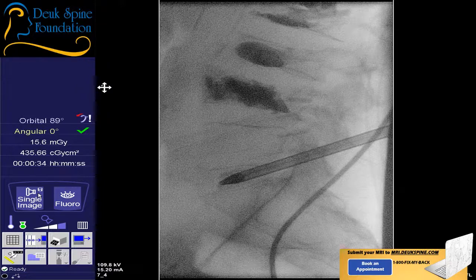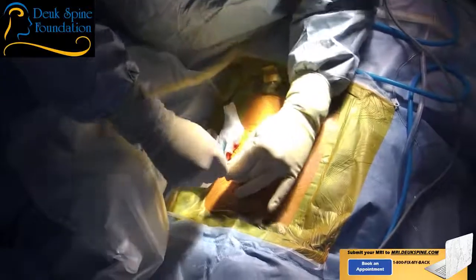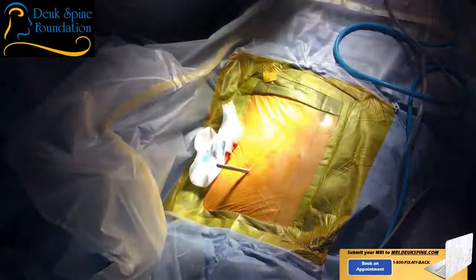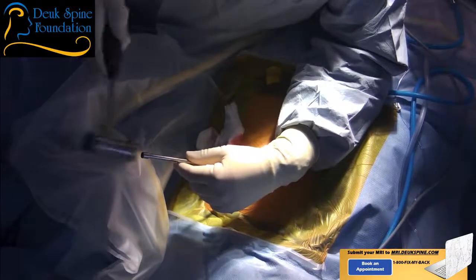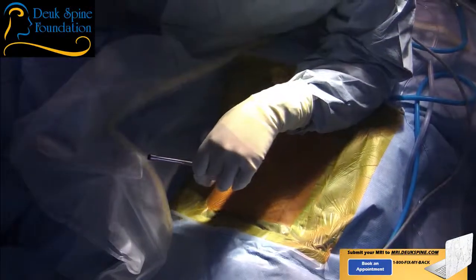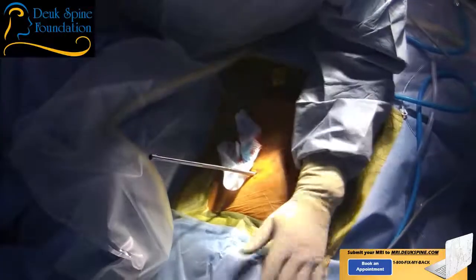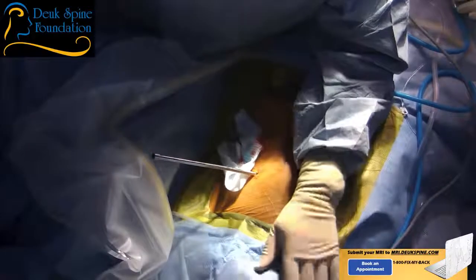This is our tubular retractor. We're going to do the whole surgery through this. Heart's doing good. If you're going to give him anything, this would probably be the time to give him a little whiff of something. I know propofol doesn't give any pain relief. Just relax, everything's okay. You want me to wait a minute? You're doing fine, it's okay, we're in that bad disc. It's going to feel a lot better when we're done.